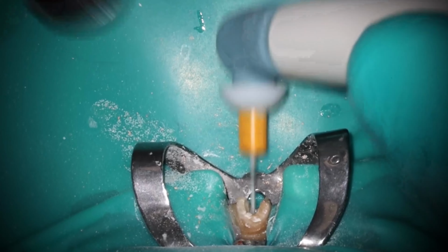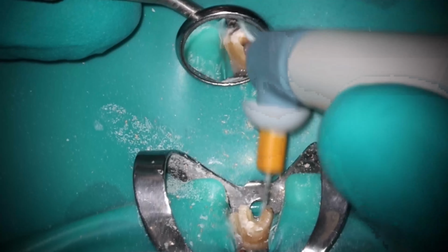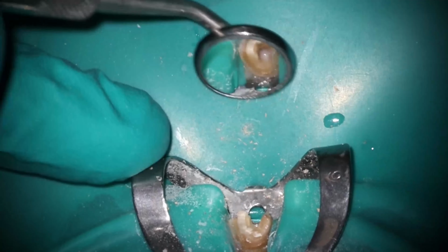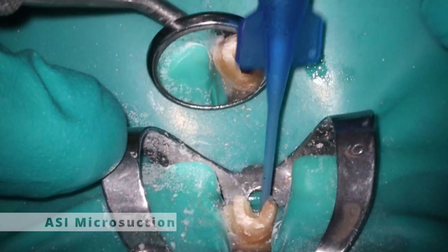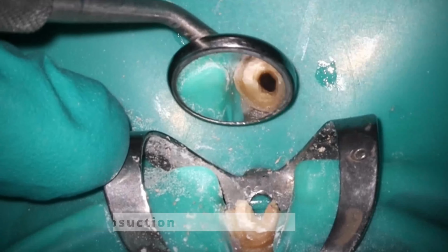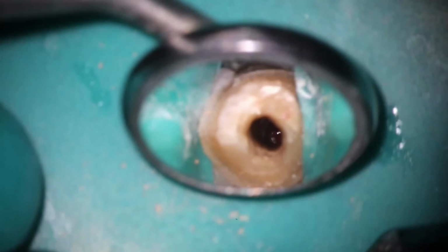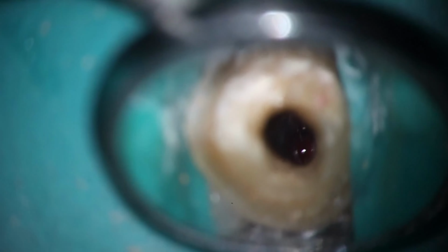So this is why I elected to go forward with it, but not really concerned about a large infection here because he really wasn't having any pain. So after we activate, rinse out that nastiness, dry it. I like to use the microsuction to remove the vast majority of this. And then here's what it looks like. So you can see that is the apex of the tooth. That's one of the cool things with microscopes and larger sizes is that little red dot there, that's the apex of the tooth. We're seeing all the way down to the very tip of this tooth.